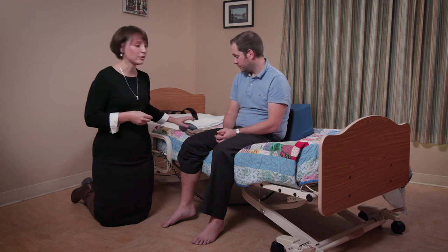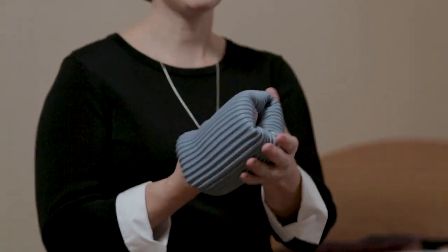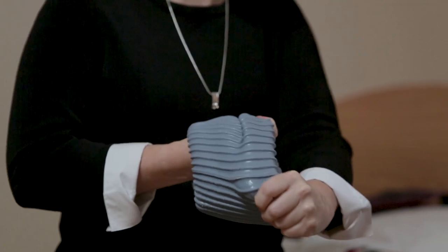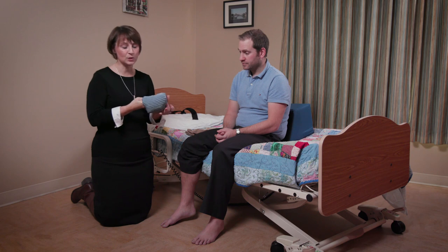When thinking about putting on compression stockings, we've considered whether there's a way to do this safely and perhaps more easily to prevent injuries. To do this, we're going to use a Dauphin Donner. This tool allows you to put the compression stocking on the client — and even though it looks small, it does stretch. We can also clean this between clients, or the client may choose to buy one if they live with a spouse who can help.